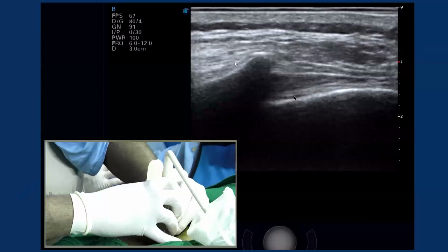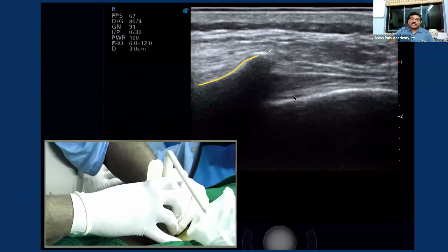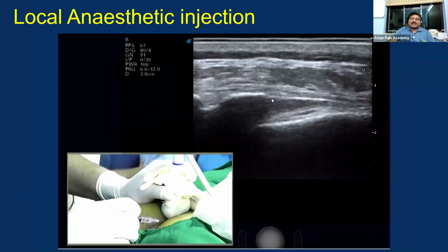Center, sir. Center. Center. Is it really the center? Little bit lateral. Little bit lateral. That is correct. It is not at the center. We are examining, but this is not at the center because this projection is usually seen laterally, which I will show. And if we go exactly at the center, it will look like this.